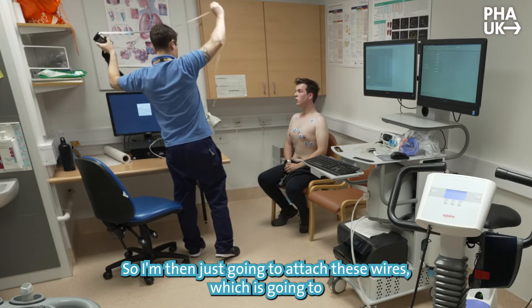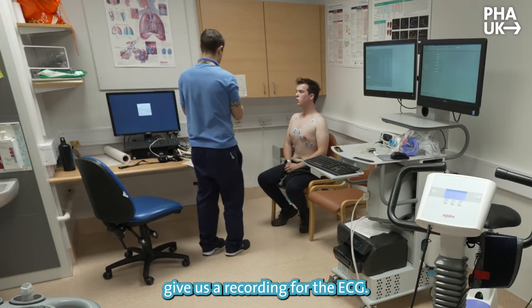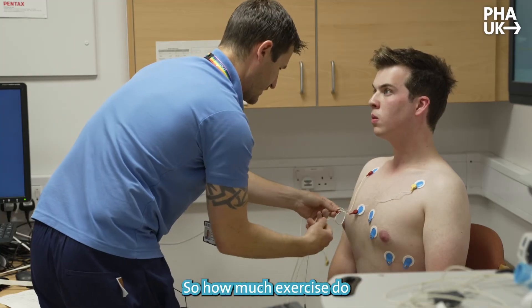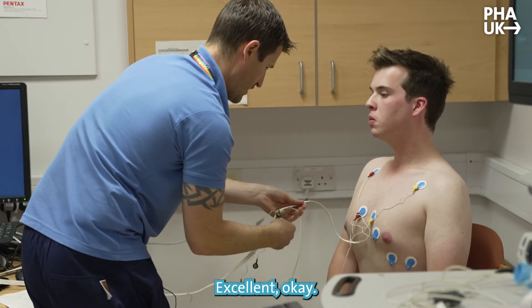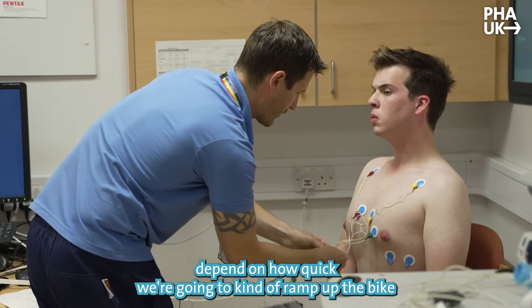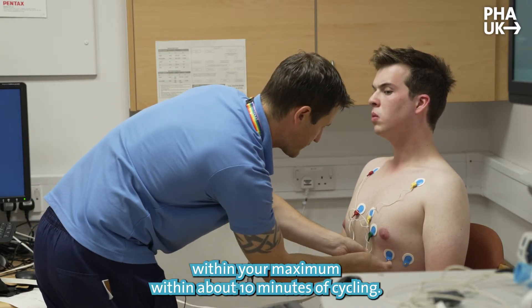I'm just going to attach these wires which are going to give us a recording for the ECG. So how much exercise do you generally do Adam? I usually swim most days. Excellent. So the amount of exercise you do determines how quickly we're going to ramp up the bike resistance, because we want to get you to your maximum within about ten minutes of cycling.